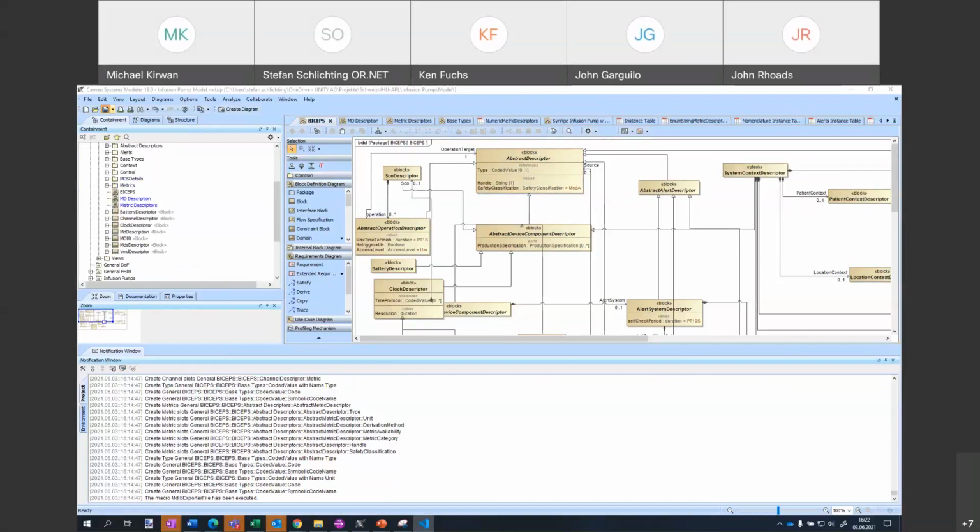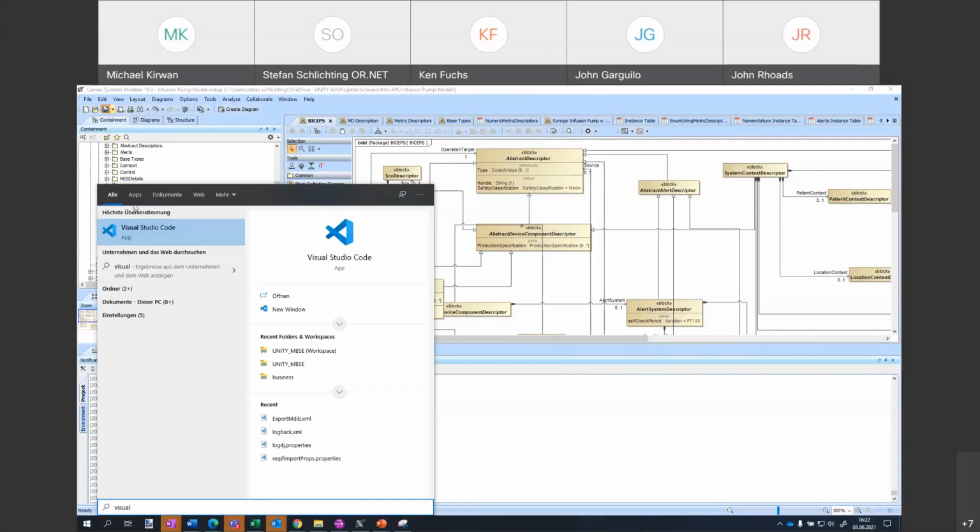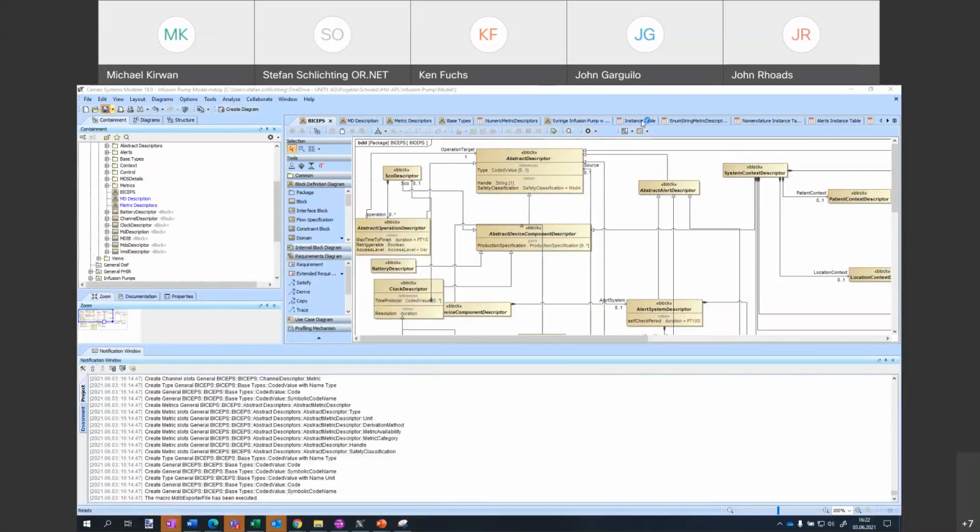And yeah, there's some parts, for example, I think there were a few places where you just punted and used a string representation as opposed to going down to the next level and modeling it in finer detail. That's stuff that we can do later on. Yeah. For example, it doesn't validate if the period of time, like the duration, is really an XSD duration string. It accepts every string. This will only be found out if you generate the XML file afterwards. Right. Which is totally fine, I think. And where you could, of course, have modeled this really like a duration using the right constraints and so forth in SysML, but I didn't do that part yet.